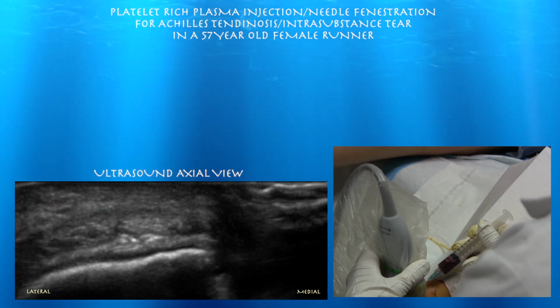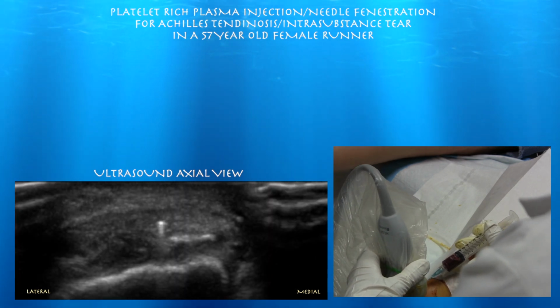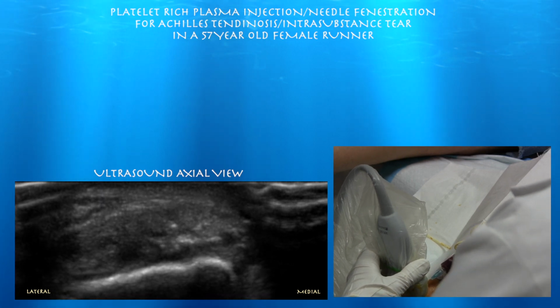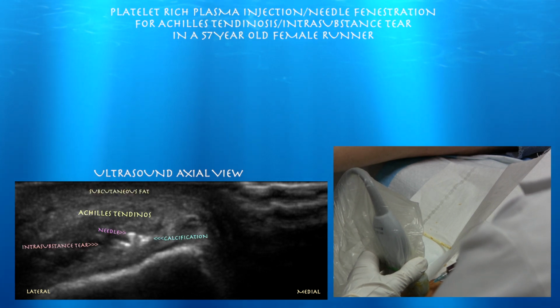Third clip, we're doing an axial view clip. Left side of the screen is lateral, right it's medial. And you can see my needle on the bottom. So it's good to use your axial view just to kind of figure out where you are medially and laterally. Also, we're going in and out of that intrasubstance tear. You can see that on the axial view to try to stimulate healing.